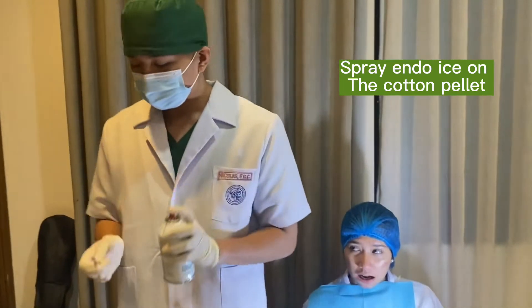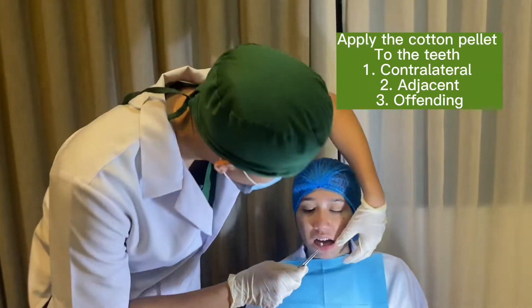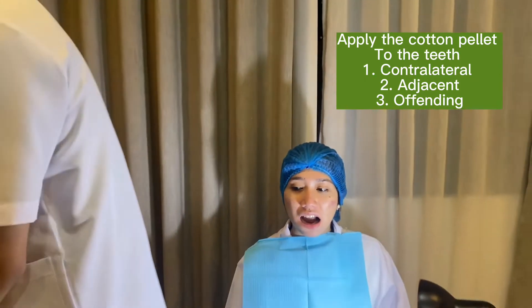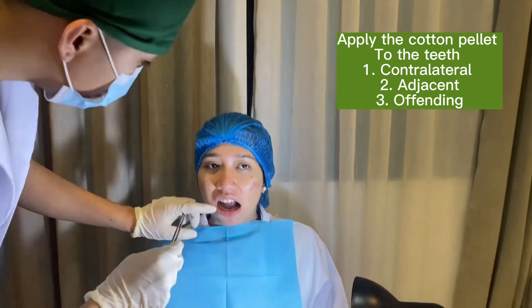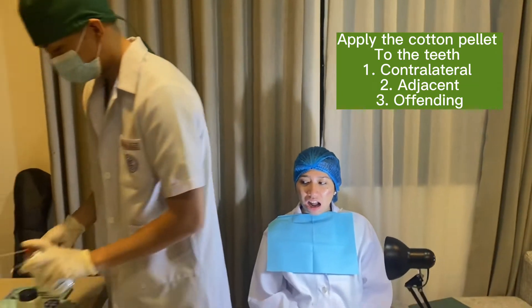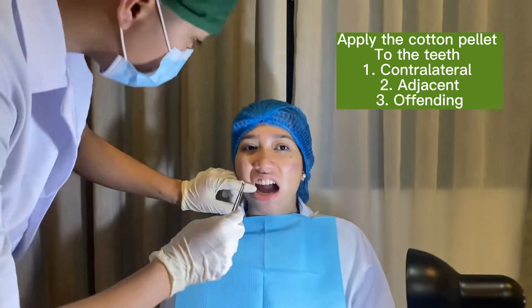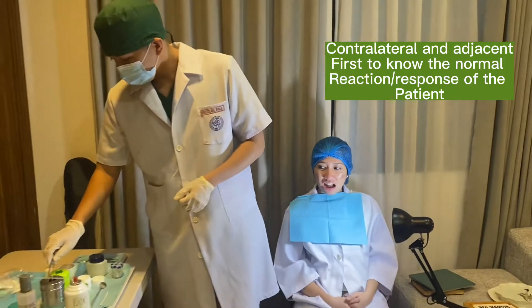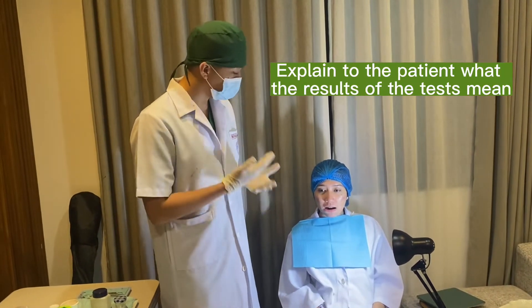Good test. So all your reactions are normal. It indicates normal, healthy, and perfect teeth.